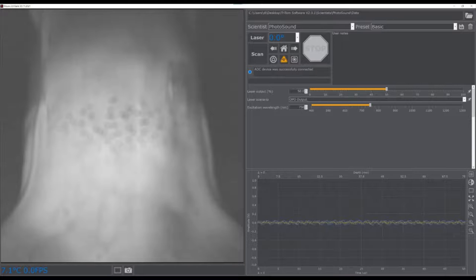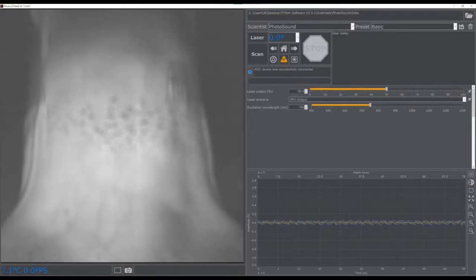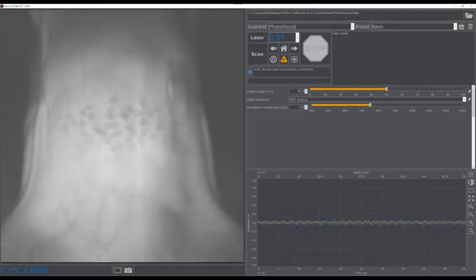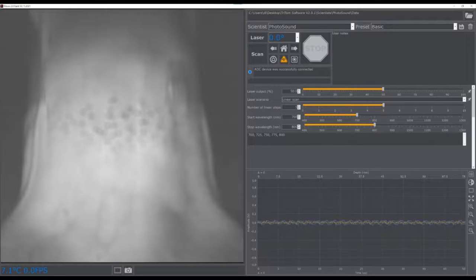Below the emission filter menu is the laser output energy control and laser scenarios available, which includes an OPO output for acquiring a scan at a single laser wavelength, and a linear scan which acquires a linear set of wavelengths in a single scan.